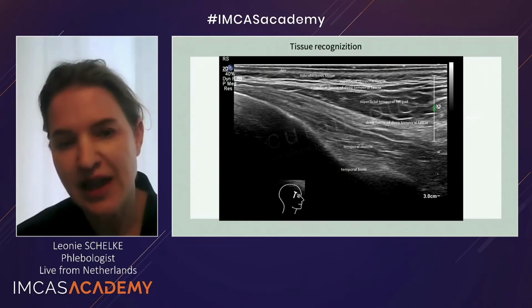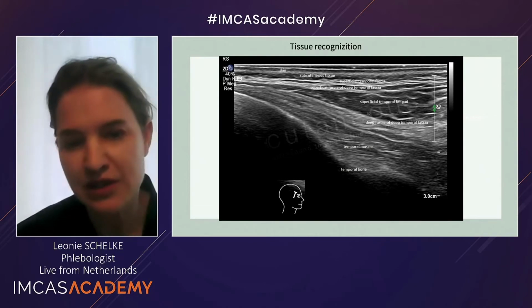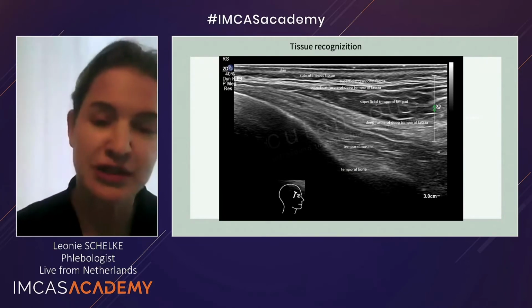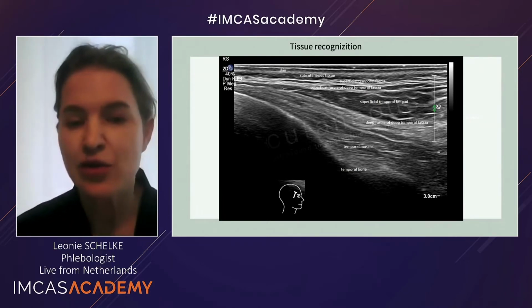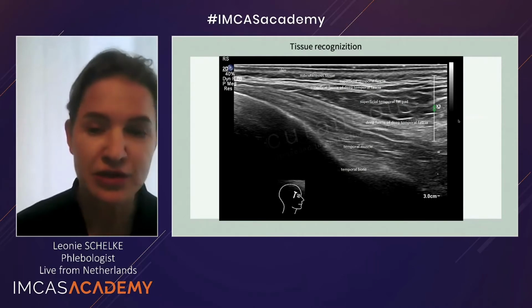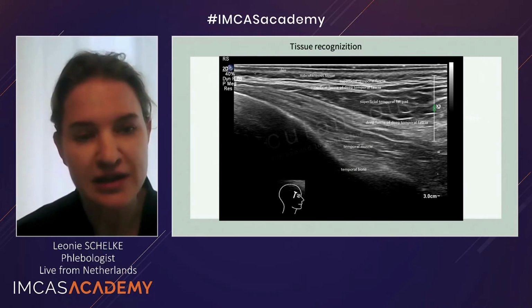If you look in this area, you will see that it resembles the subcutaneous tissue, a bit like this area. This is how fat will look to you, and this is the superficial temporal fat pad, nowadays called the intermediate temporal fat pad. You know it is enveloped with fasciae, and fasciae are dense and will look white on ultrasound. So here is one layer, there's the other layer of the deep temporal fascia. They're fusing here. And here we have the superficial temporal fascia.